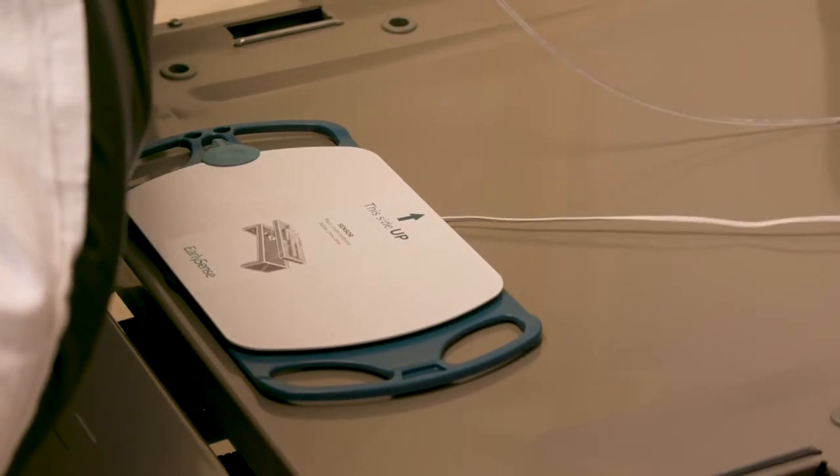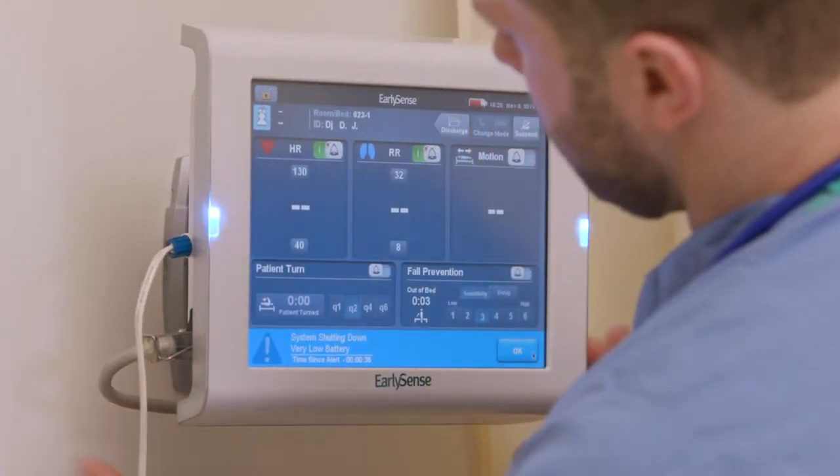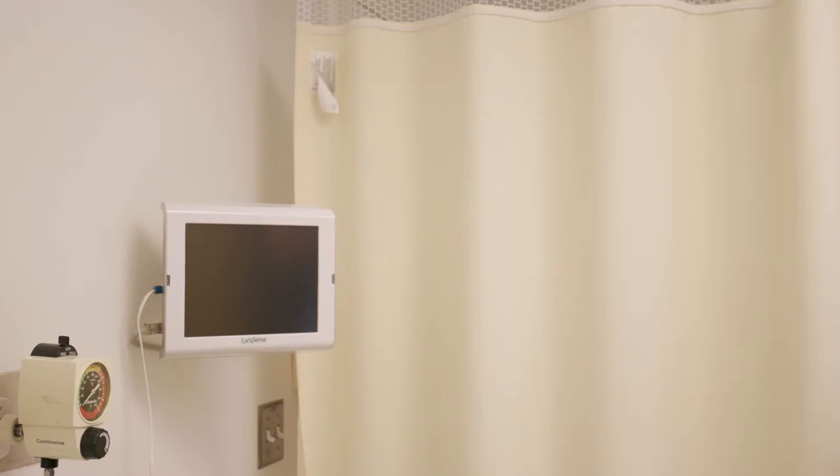Secure the sensor cord to avoid the patient stumbling over the sensor. Also, make sure the ES2 bedside unit is connected to the AC power. If the ES2 bedside is not already on, turn on the system by pressing the On button on the side of the device.